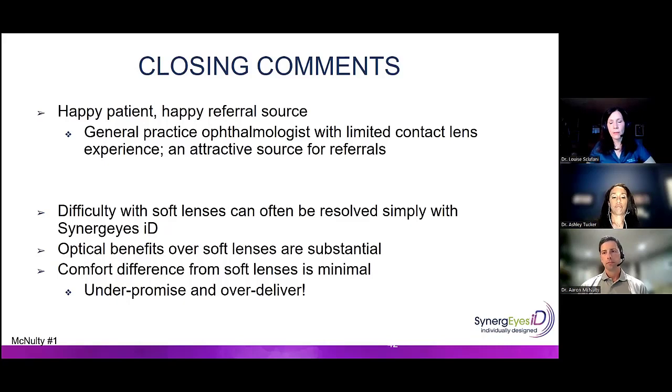And as you could see, the decay could have been an issue with that previous lens design. The optics obviously aren't as good as GP optics. I'm sorry, when we get to those higher powers, especially, it's a big deal, not just for astigmats, but for higher powers. And your staff really did all the work.